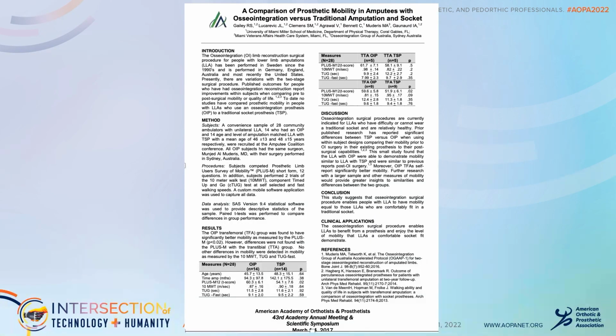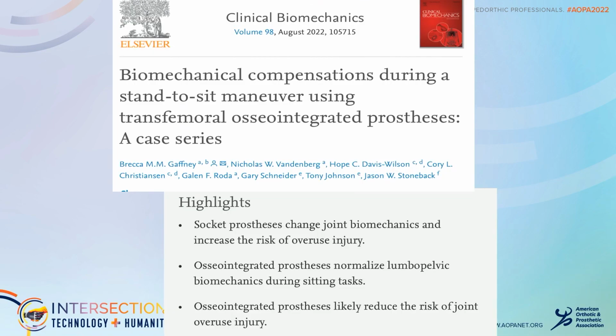Some of you might have heard of a guy named Bob Gailey. Bob Gailey is my favorite physical therapist. He teaches people how to run that wear a prosthesis. Bob Gailey gave a presentation at this very conference that says that when somebody has good osseointegration, they are the same or better as someone that has an excellent prosthesis. Notice that's the best prosthesis, not someone that's having a problem with their prosthesis.